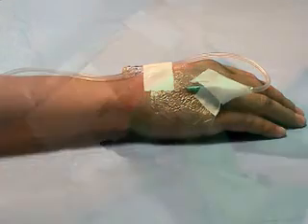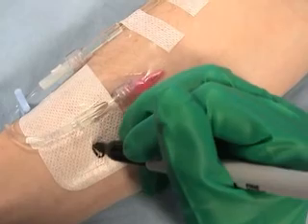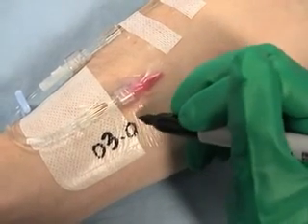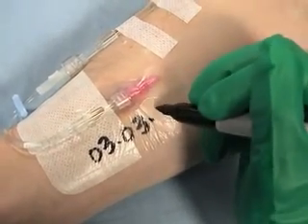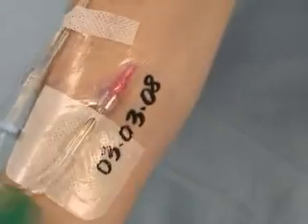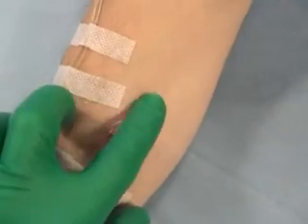It is recommended that you write the date of insertion on the dressing to facilitate determining how long the cannula has been in place. To reduce the risk of infection, continue to review the indications for peripheral intravenous catheterization and remove the cannula as soon as possible.